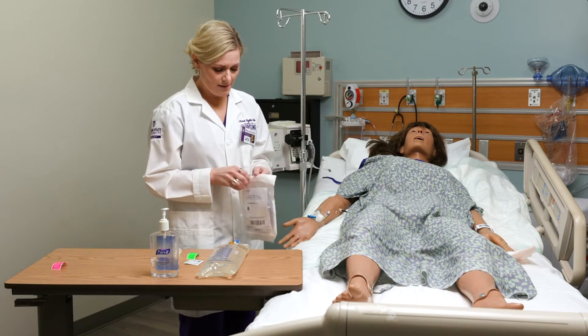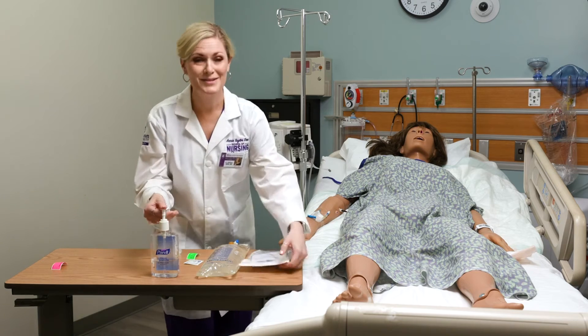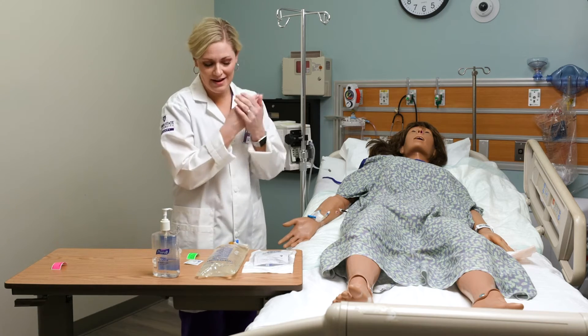First thing — actually, I'm going to do hand hygiene. I should have done that when I walked in the room. I'm going to do hand hygiene.